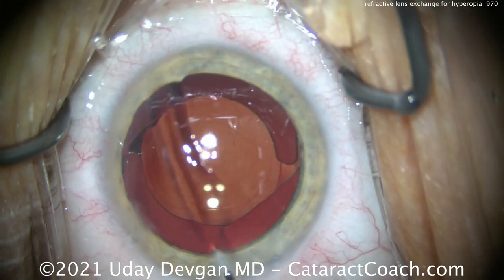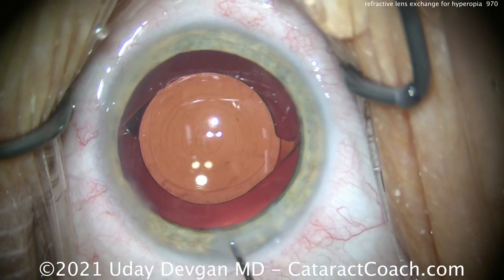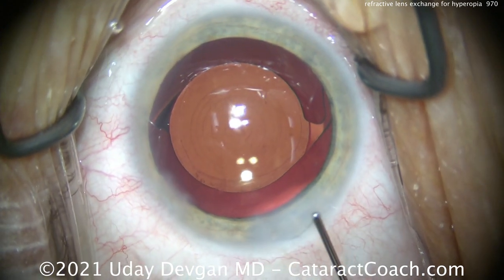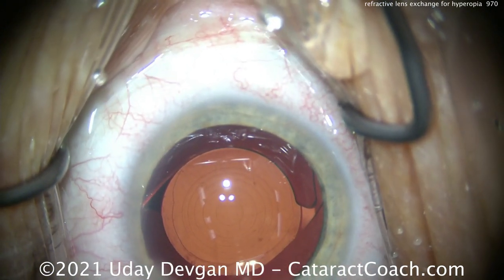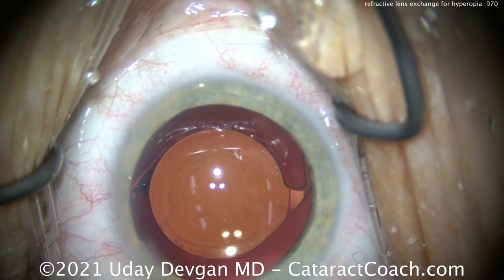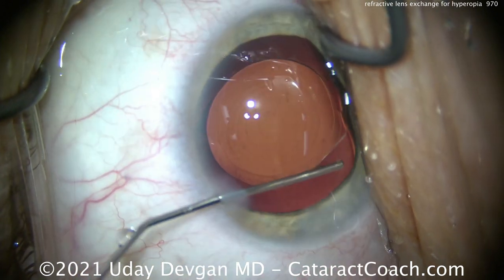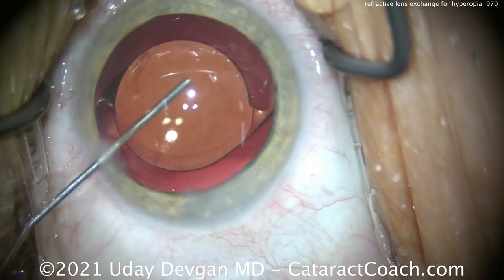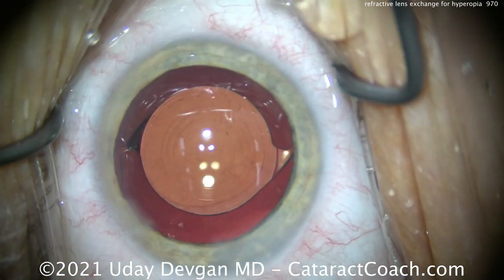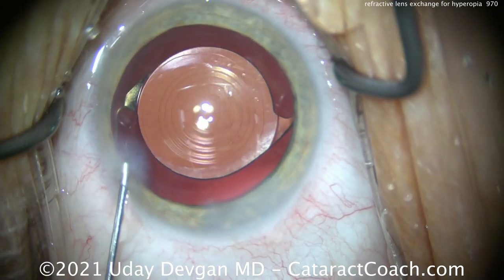There's the new lens in the eye. We're going to seal up our incisions and make sure the IOL is well-centered in the patient's visual axis. We're going to line up the Purkinje images with the central zone of the IOL and make sure that optic is securely placed behind the capsulorrhexis. BSS on a cannula is being placed inside the anterior chamber, sweeping around to remove any viscoelastic — let's get that lens beautifully centered. The Purkinje images look great.